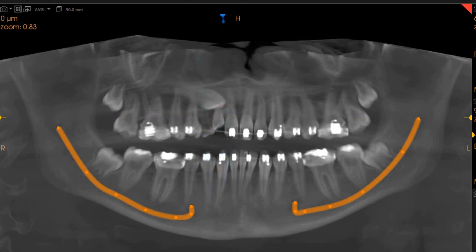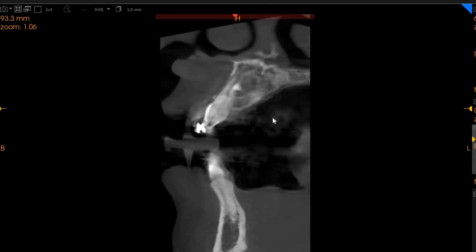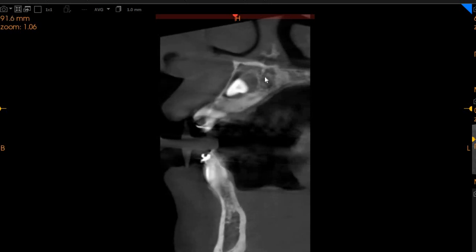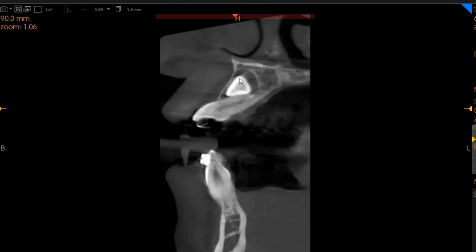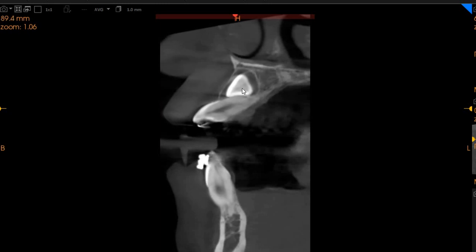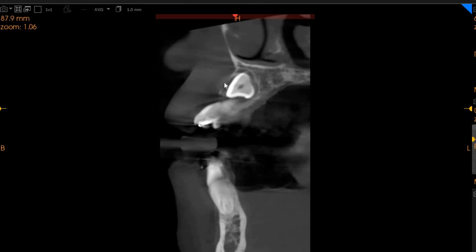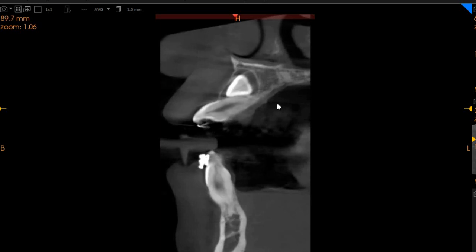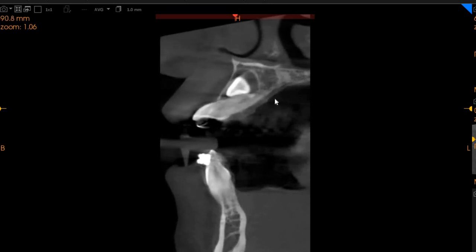On the transaxial view, we will take you through each and every section. This is the central incisor, the upper right central incisor. As you can see, this is the crypt of the canine. The canine is placed buccally to the lateral incisor — it's actually superficial and buccal, not palatal. It is closer to the buccal cortical plate, which has not yet been perforated. The lateral incisor root does not show any signs of resorption at the moment.